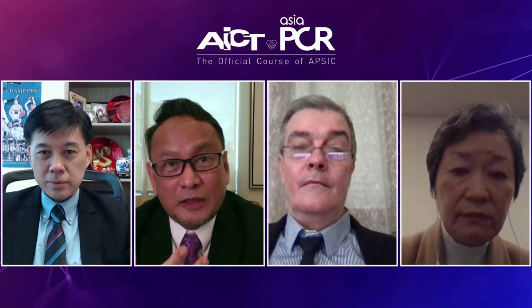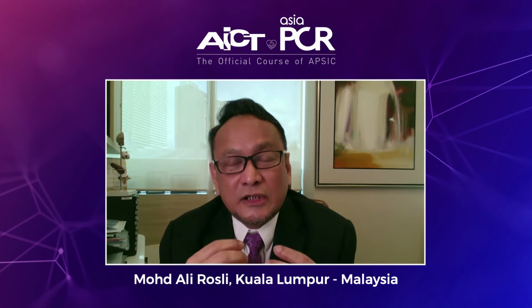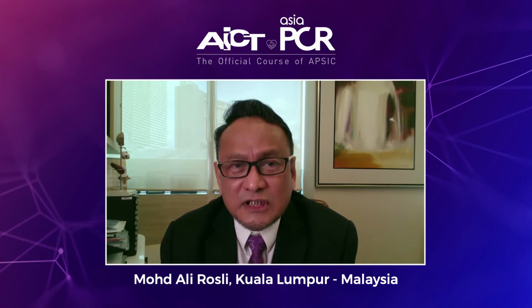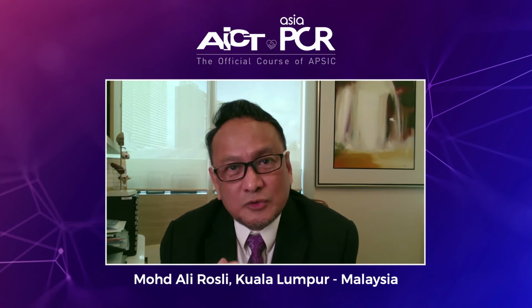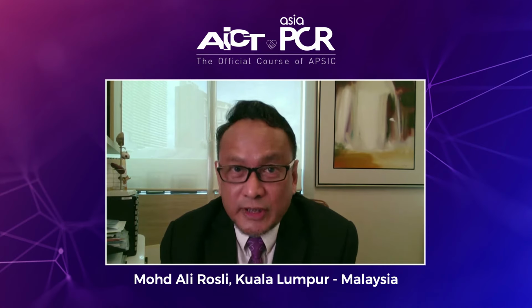Yeah, I agree fully because Kang's paper, I think, is quite important to help guide us. But as Dr. Honye said, it depends so much on the vessel size. So if the vessel is not large, that will be sufficient. But if you've got a large vessel, then you should aim to go as much as you can. Because I had one case recently, I thought I had reasonable results from IVUS, from Kang, slightly better than that, but the patient actually came back. So we treated and made it to an appropriate size. I just want to reemphasize the point that those are just guides, but if you have large vessels, you should aim for better results.